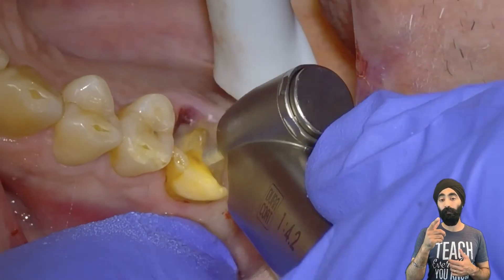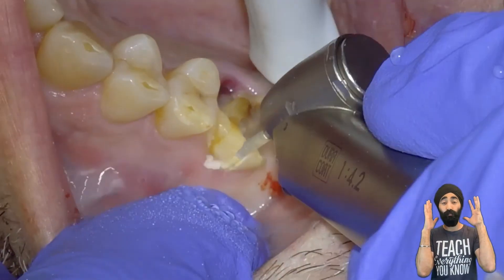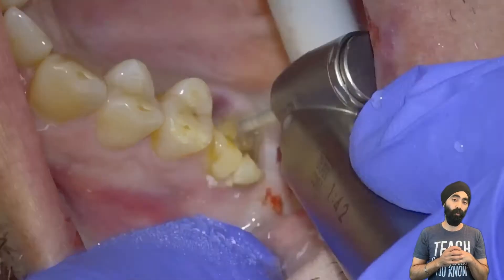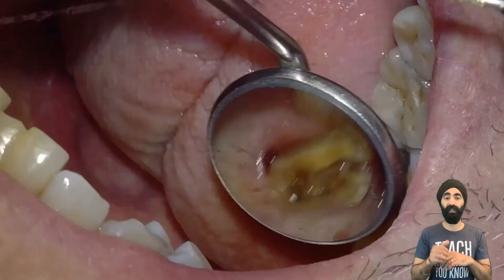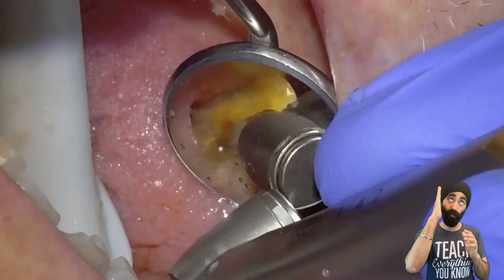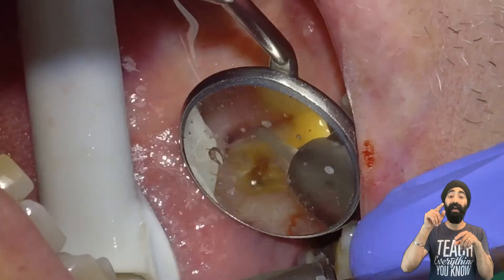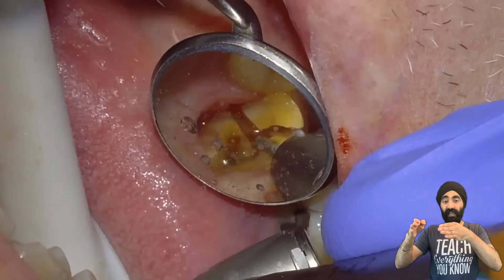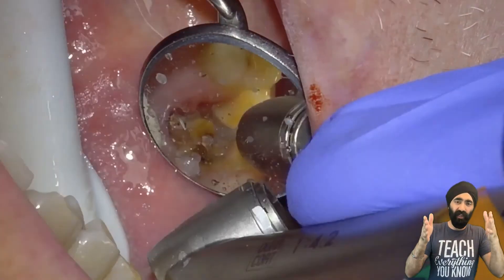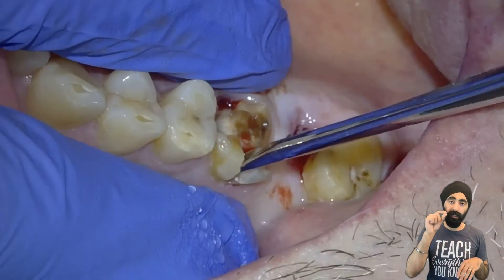Now I'm getting my electric handpiece, which has a 45-degree angle. This handpiece is brilliant for wisdom teeth and whatnot. It's electric, not air-driven, and I'm doing my sectioning. I know I've got my section — the mesio-buccal and disto-buccal roots have been sectioned. As you can see, I'm making a T shape, or a Mercedes shape, whichever way you want to think about it. It's got a bit of a slant to it, and then I start luxating.